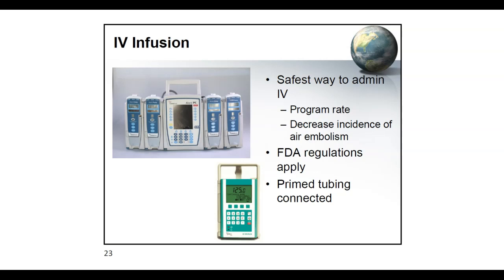Also, when you program and use the machine, make sure that the tubing is primed and obviously connected. This is a different type of infusion machine or IV pump. I honestly haven't seen that before. Maybe it's for a specialty. If you guys know, please feel free to share with everyone. I honestly haven't worked with this machine. I used the Baxter ones, the really old boxy ones. And when I first went to nursing school, my first attempt at going to nursing school, we used to count the drips. So that was a long time ago.